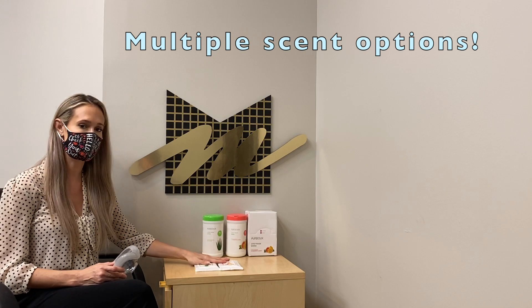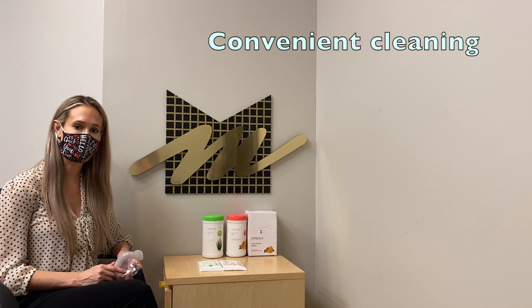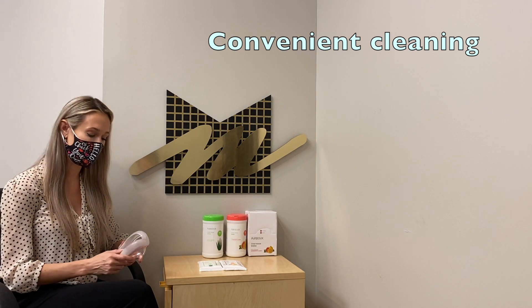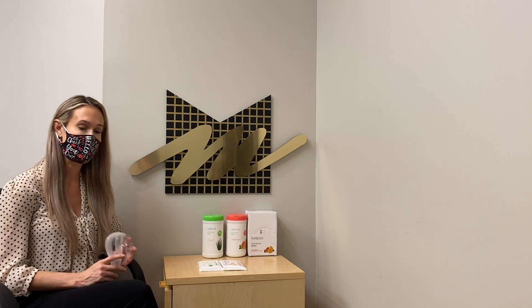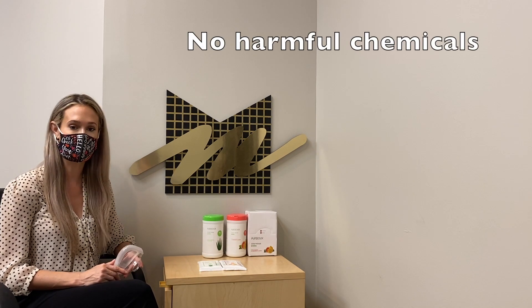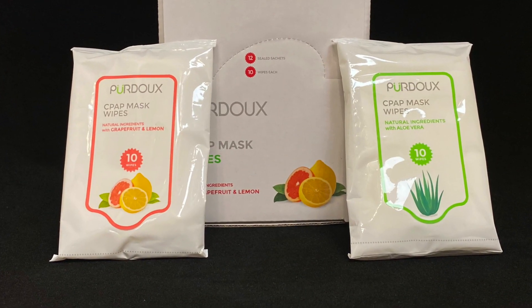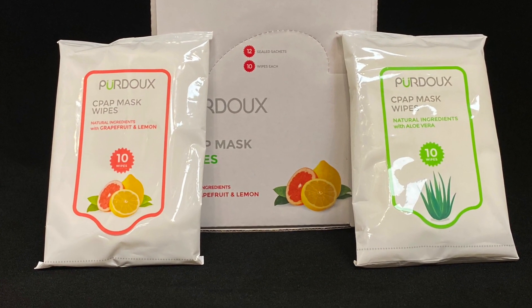They come in a couple of different scents for you to choose from. They're great to use when you first wake up in the morning to help prevent the buildup of sweat on your mask. They do not contain any harmful ingredients and they're also a great alternative to using soap on your mask. They come in a travel size so when you're on vacation you can take them with you.